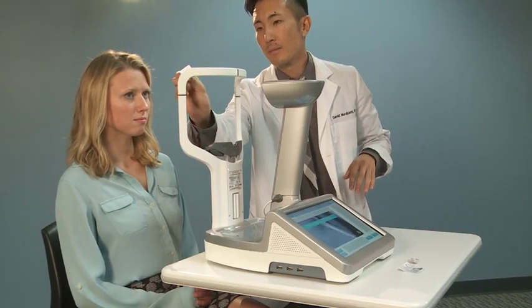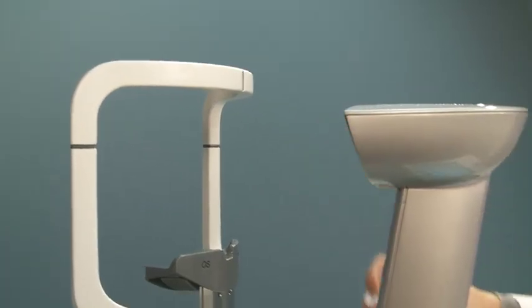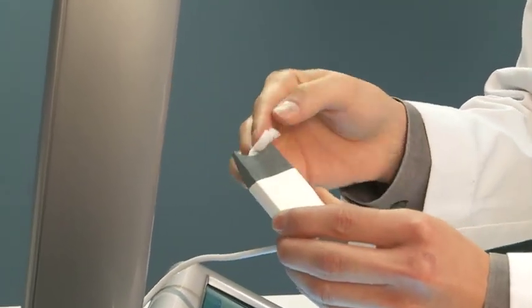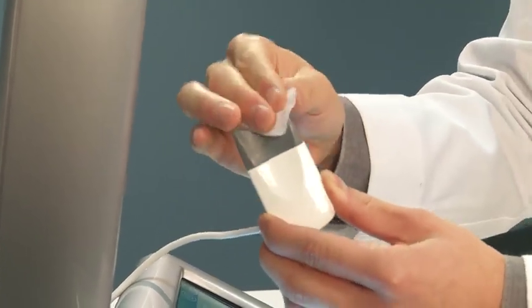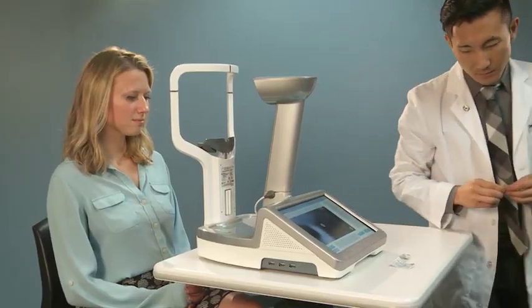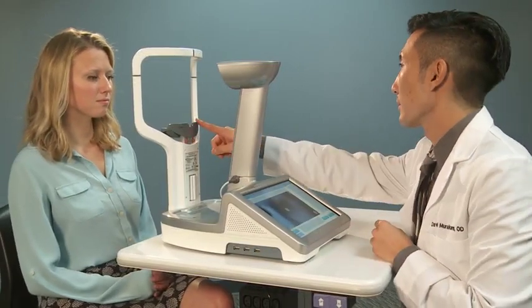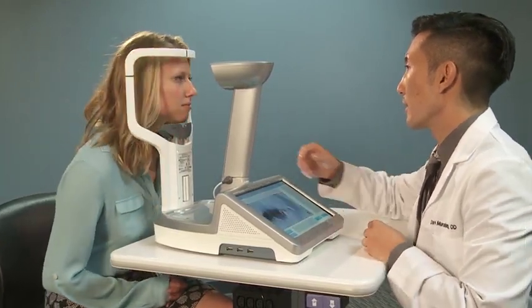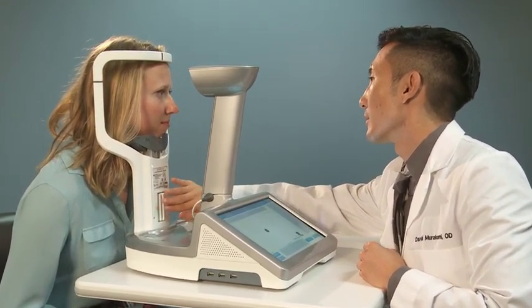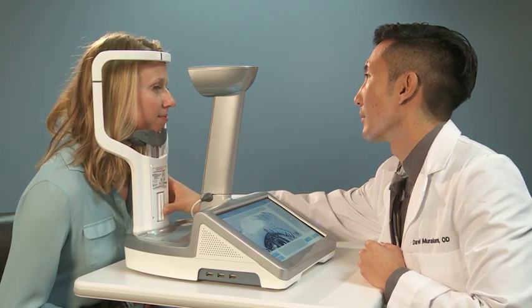Before beginning imaging, disinfect the forehead and chin rest and the handheld near-IR lid everter with 70 to 90% concentration isopropyl alcohol. Inspect the patient contact surfaces of the lid everter to ensure they are smooth and intact before using to evert the patient's eyelids. Position the patient properly into the chin and forehead rest. Position the chin in the opposite direction of the eye being imaged, to the right for the left eye and to the left for the right eye.